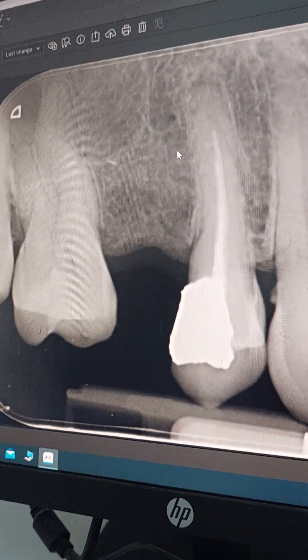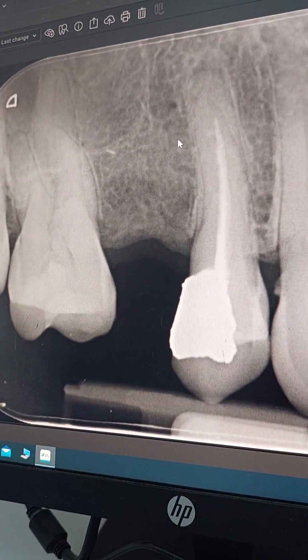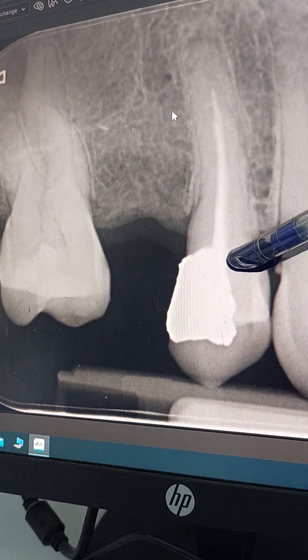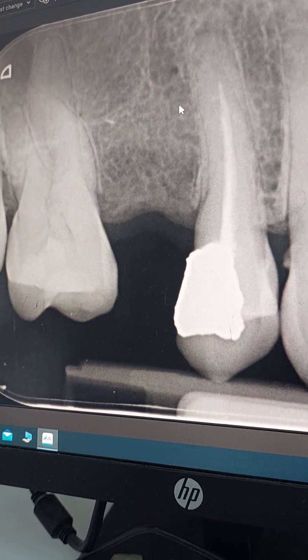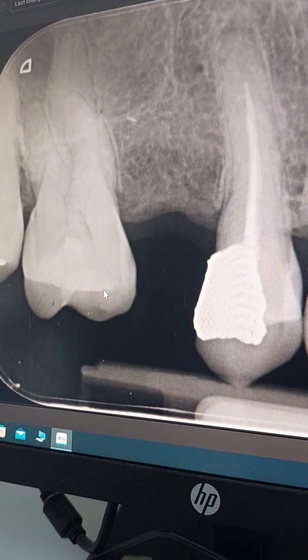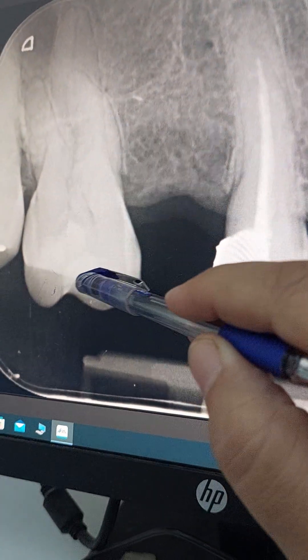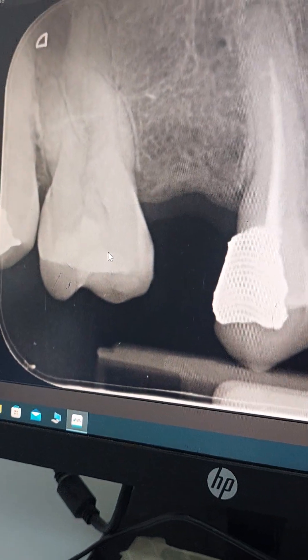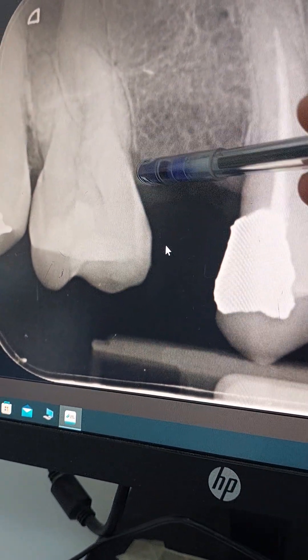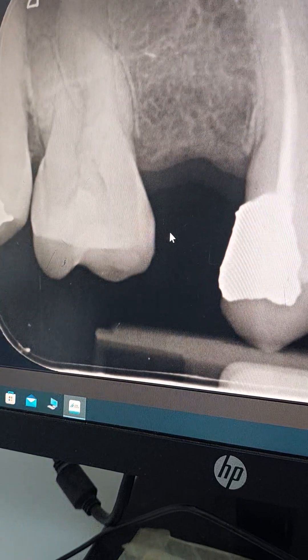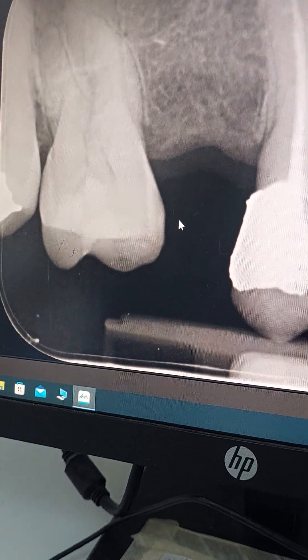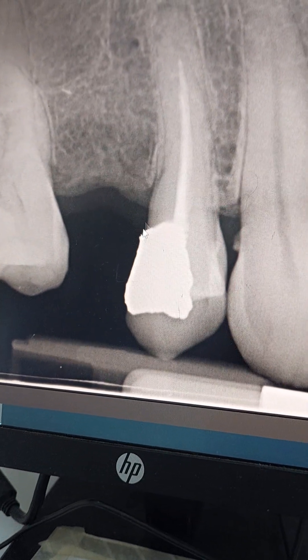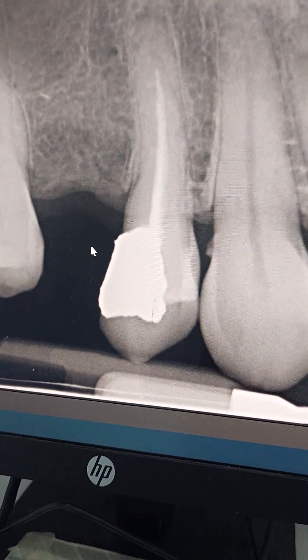This is another case for evaluation for conventional bridge work. We have this tooth that has been endodontically treated, and this adjacent tooth that seems to be sound with a small composite filling. Periodontally — bone level, roots, periodontal space around the roots — all are okay.